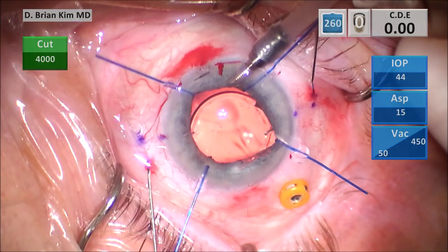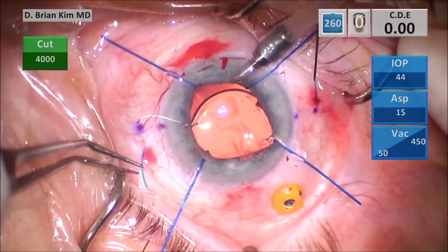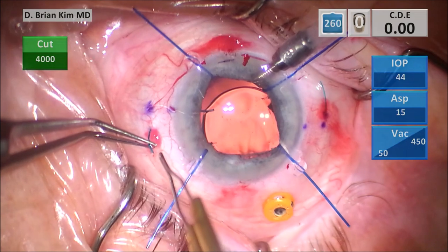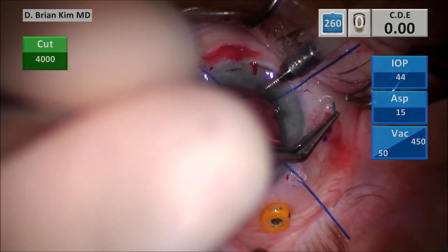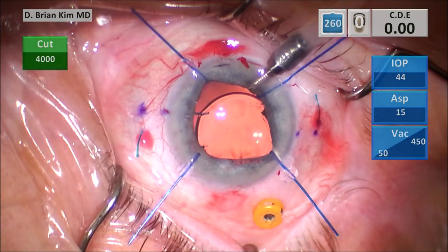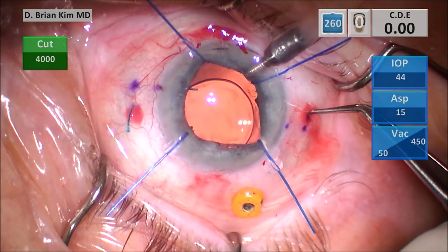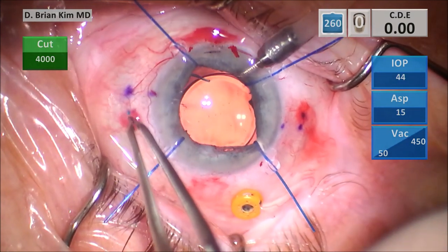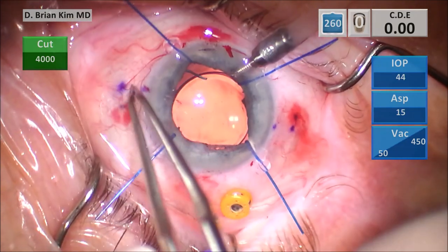As I pull the needles out, you want to pull them in the direction they came. On the left side, pull toward you; on the right side, pull away. You can see quite a bit of haptic comes out. That's the difference from the CT Lucia — sometimes with the CT Lucia it can slip a little. With the Sensor lens, it's a much tighter fit. It's only a problem if you push and you're not straight, and then you damage the haptic. If you do it correctly, it's actually advantageous because when you pull it out, it doesn't slip back in. Now I push the haptics flush to the sclera. When you do it that way with a small bulb, it doesn't cause erosion — it's flat and snug in the sclera. I haven't had any problems with erosion of the bulb.